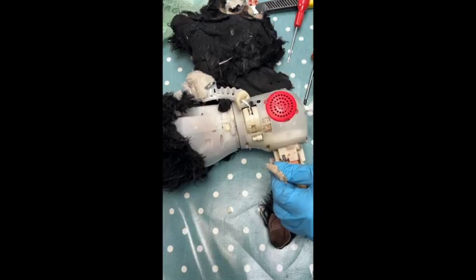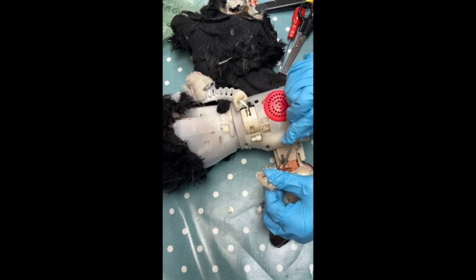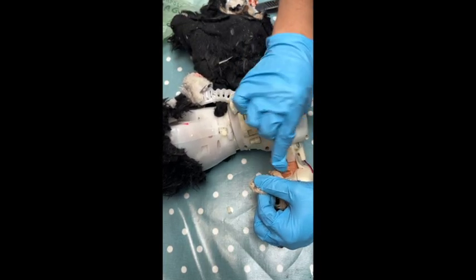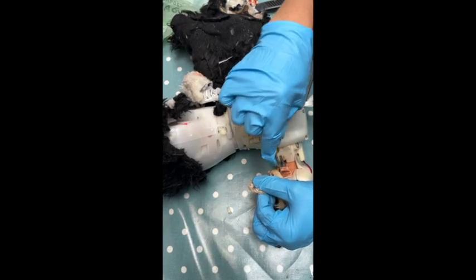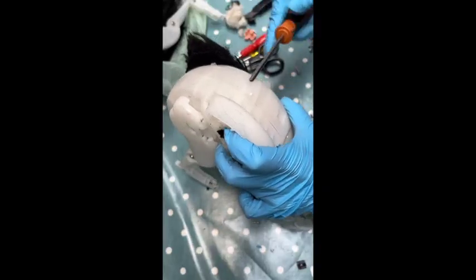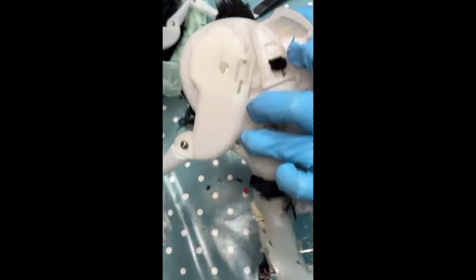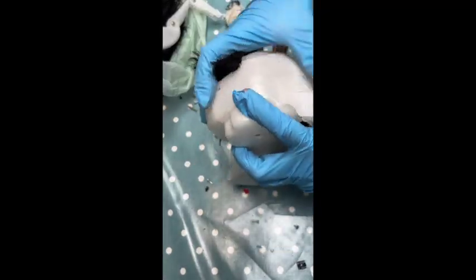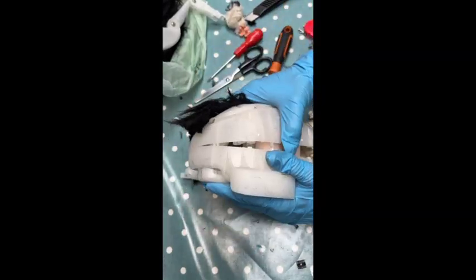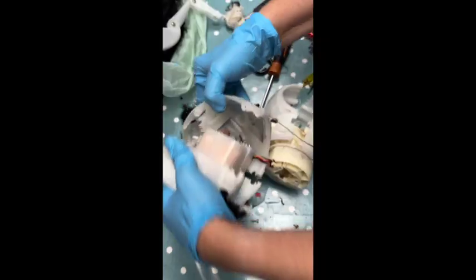So I'm just going to cut the elastic. Looks really hard to. I don't think I can leave it. Have a look. See what it's looped to. Yeah, looks like it's. Oh no. It's pretty much just the batteries area in there. Nothing terribly exciting.